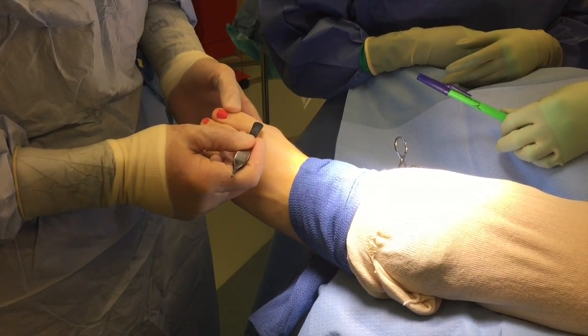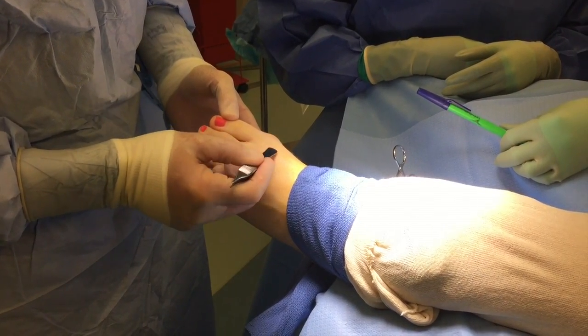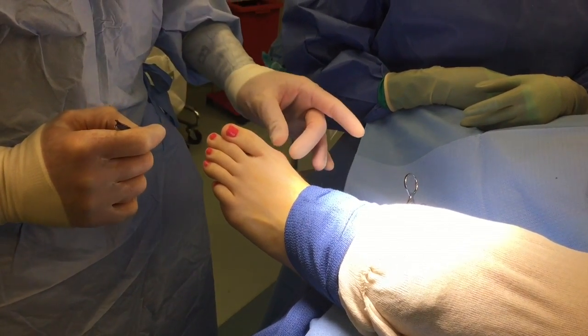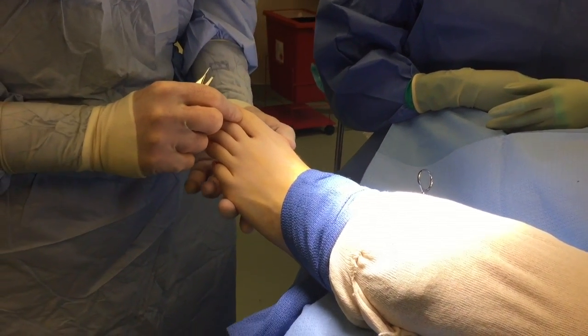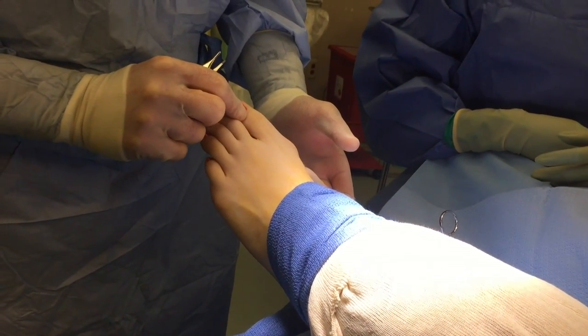We'll do less of the traditional long incision — we'll do a small incision here and also stitch it underneath the skin. Uniquely, as we move this head over to correct the bunion deformity, it is a V-osteotomy, basically a bone fracture.